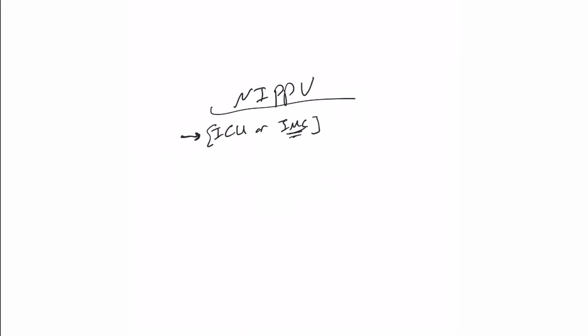So that's important. When we round on them, remember, once we put them on, get a baseline ABG of course, and repeat ABG within 1 to 2 hours, sometimes 30 minutes even, and readjust the settings accordingly. Try to decrease FiO2 if you can, and adjust the pressure values, the pressure support values, according to their ABG.